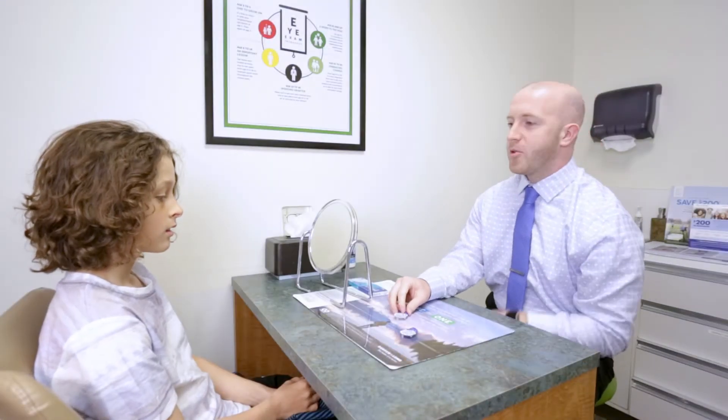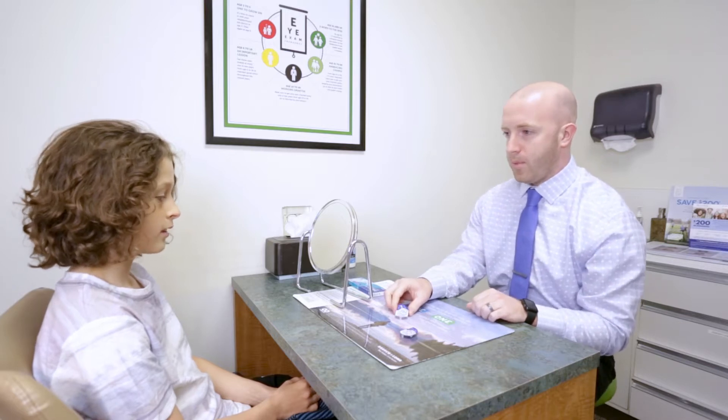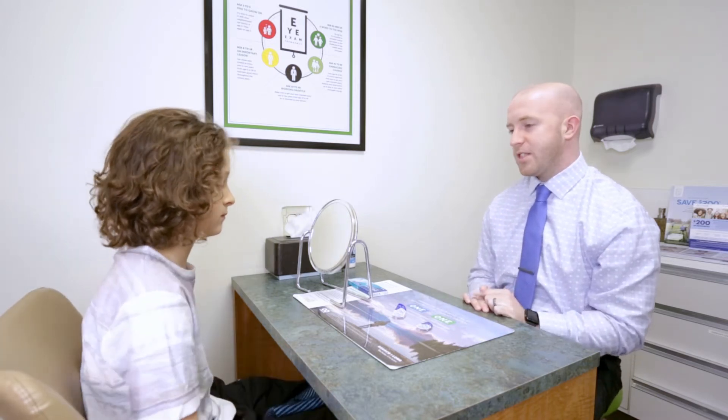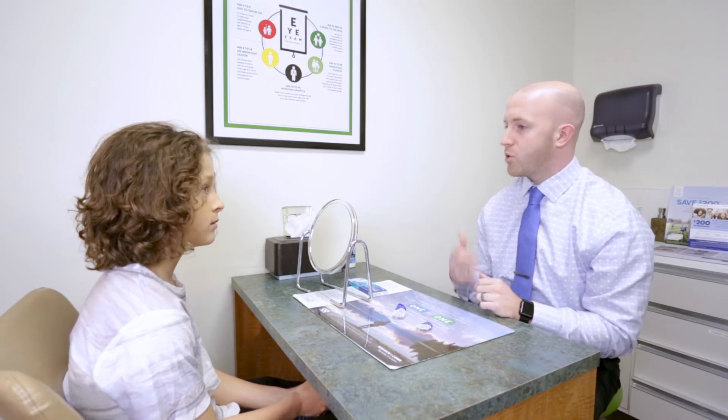All right Jaden, so this is the first time we're doing contacts, correct? Never worn them before at all. Perfect, well we have some in your prescription here that we're gonna try out. The first thing we always do anytime we're gonna touch our eyes or get close to our eyes is wash our hands.